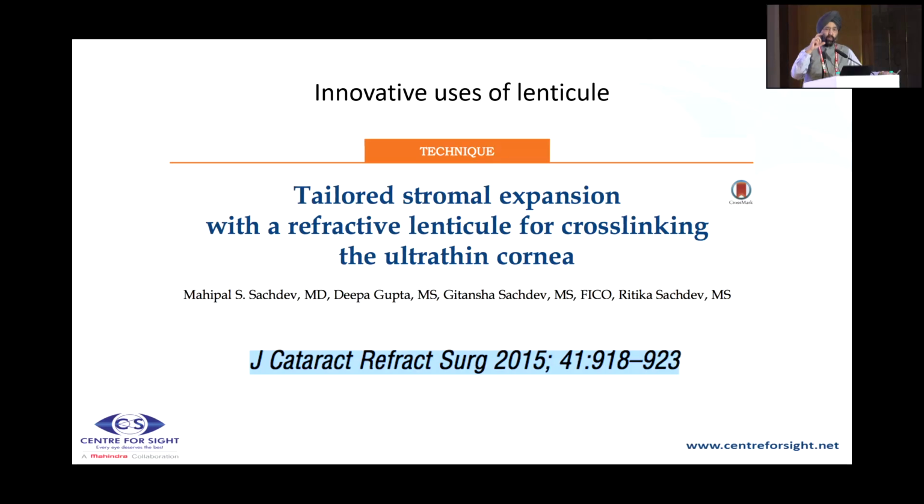So you had to artificially increase the thickness of the cornea. One way was hypotonic riboflavin, which would swell up, or Susan Jacob described putting a contact lens. But these suffered because the fibers in a hypotonic solution would spread out in a different manner and you wouldn't get the effect. The contact lens was a fixed power.